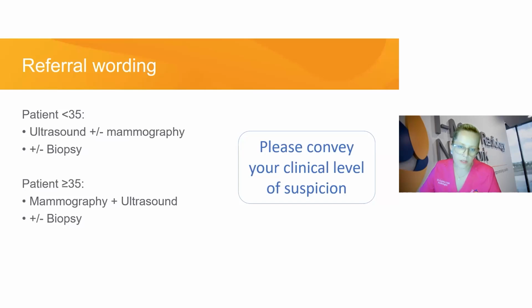The exception to this would be a completely malignant feeling mass. If you presented a referral to me in a young woman, but everything sounded very much like breast cancer, I would probably do the mammography first because I think it's going to happen regardless. But that's sort of at the discretion of the radiologist in the clinic.